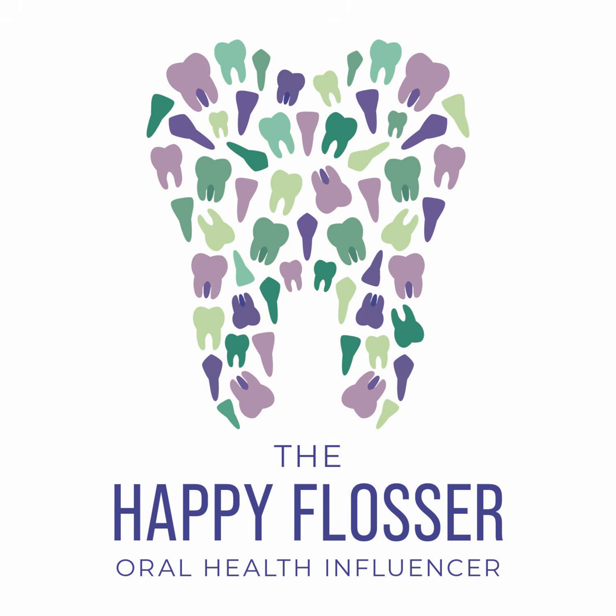So it's twofold there. It's all about patient management, patient comfort, and also your level of confidence in your ability to effectively and efficiently place the sensor where it needs to go, align the PID where you need to align it, and being confident to hit that button. Radiographs, just like anything else, just take lots of practice, a little bit of confidence building in yourself, and educating your patient about why we take them, why we need them, and how they can work with you to get that goal accomplished.